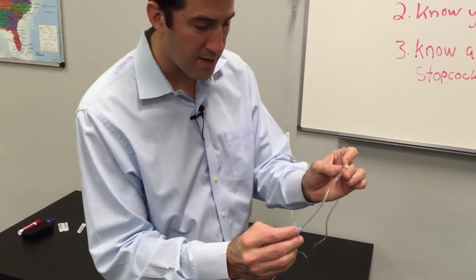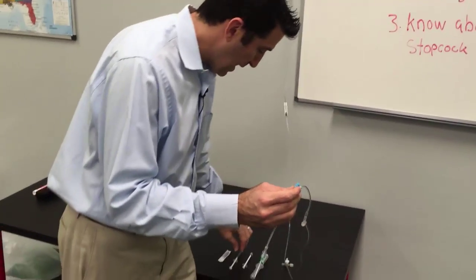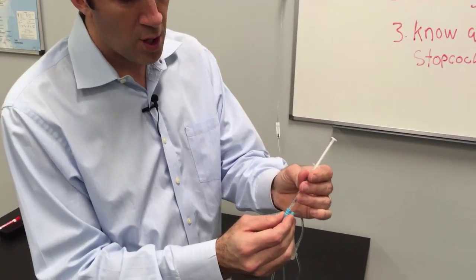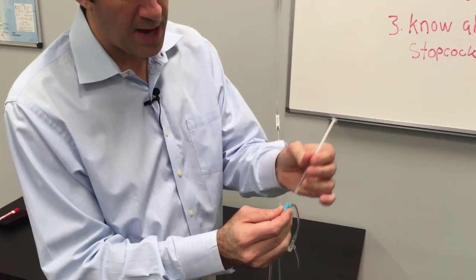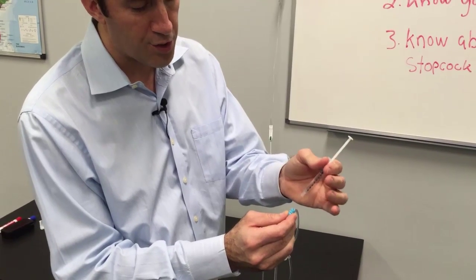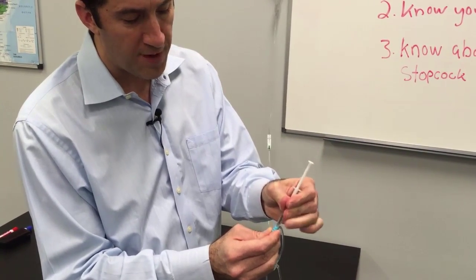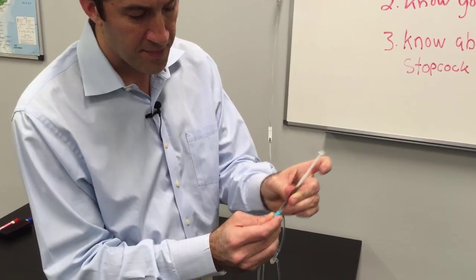Now that poses a problem with adenosine. If you use the needleless port with a non-luer locking syringe, when I put this in it just wants to pop right back out. So if you have this type of syringe and this type of port, you could still use it, but you have to hold it down and give it — that's a problem.